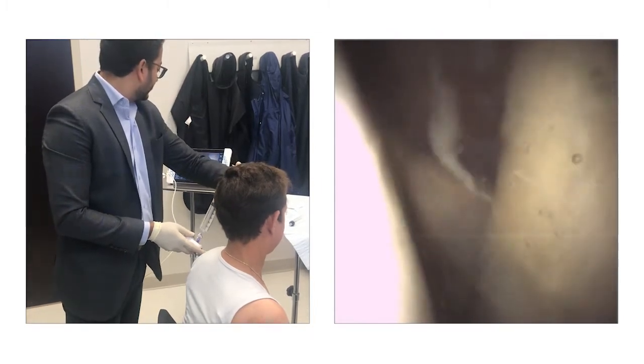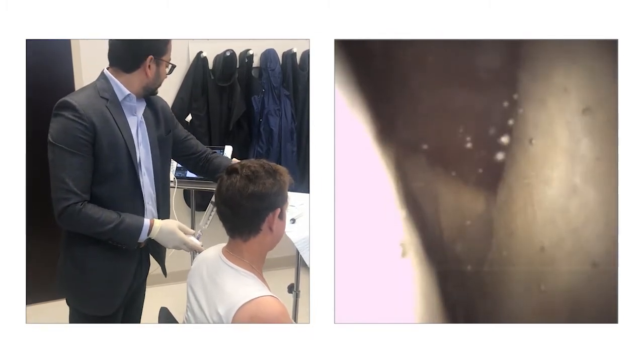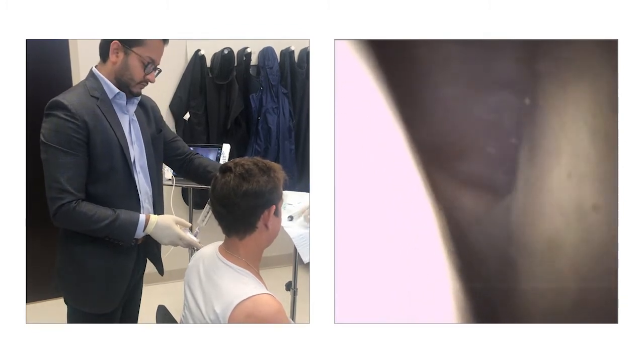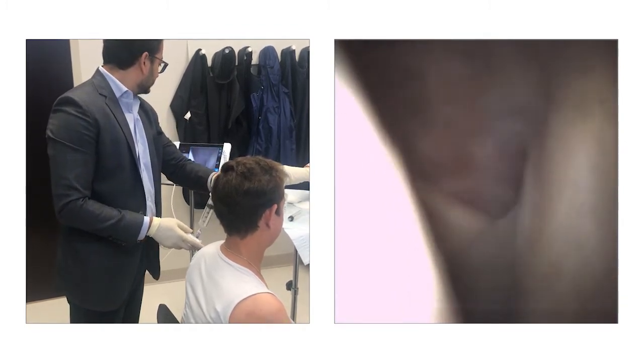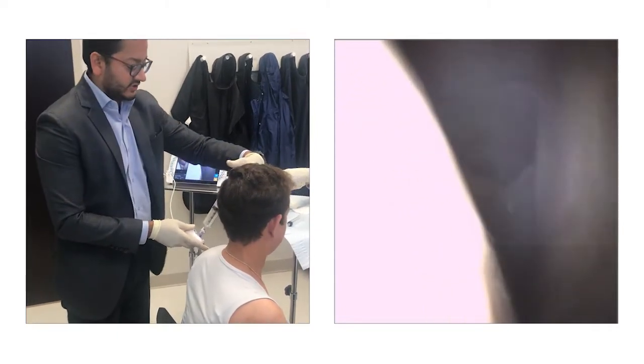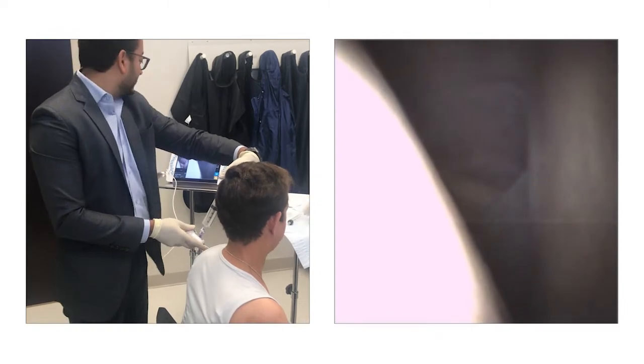Pump a bunch of fluid in. You can see it's sort of widening the joint. You're going to feel some pressure — how are you doing? You can come around, Amy, if you want.